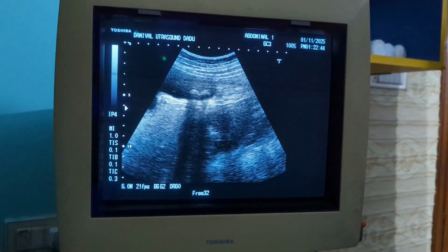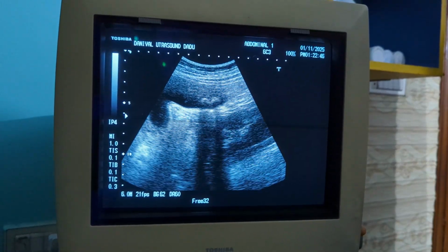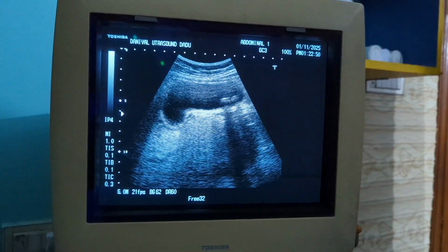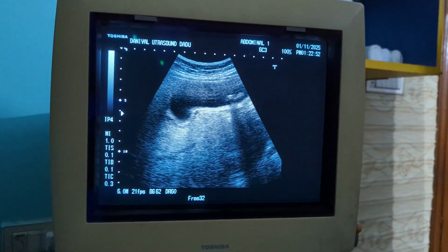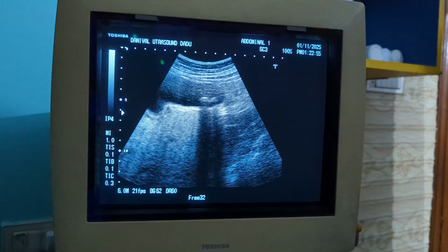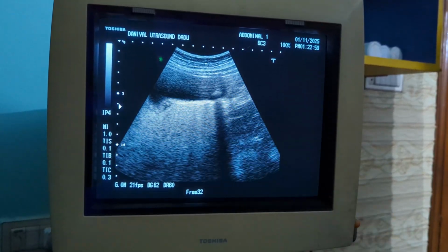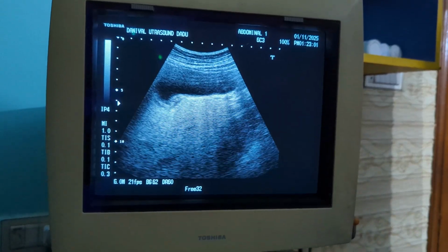This is Dr. Munir Abbasi presenting a case of gallbladder obstruction by a stone in the neck or cystic duct area, with two free gallstones in the gallbladder neck, as you can watch here.